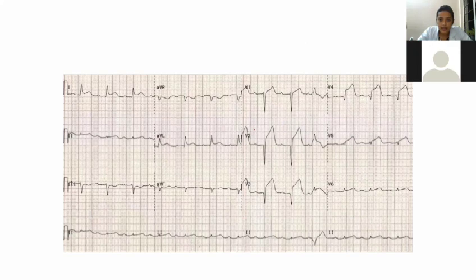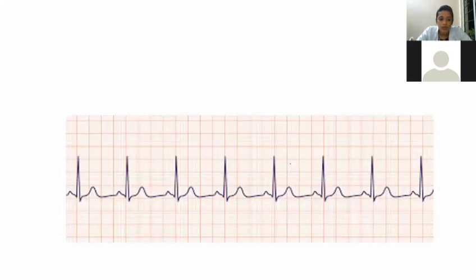So this is another ECG. Here also you can observe some abnormality, especially in V2, where you can see ST elevation. After the QRS complex, we have to observe the ST segment. So this is elevated here. You can see clearly that ST elevation is present. Okay, so this is an ST elevation. Mostly it represents myocardial ischemia. So this one you can interpret easily.